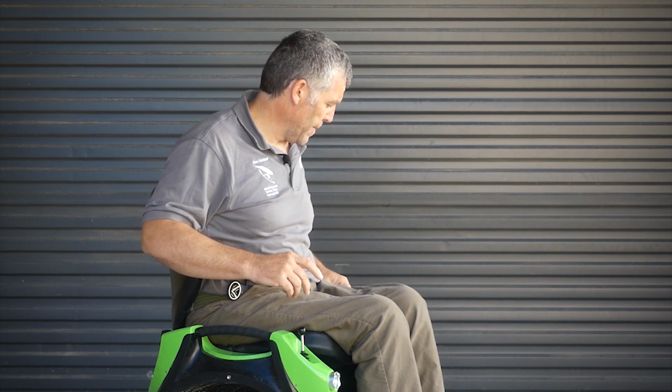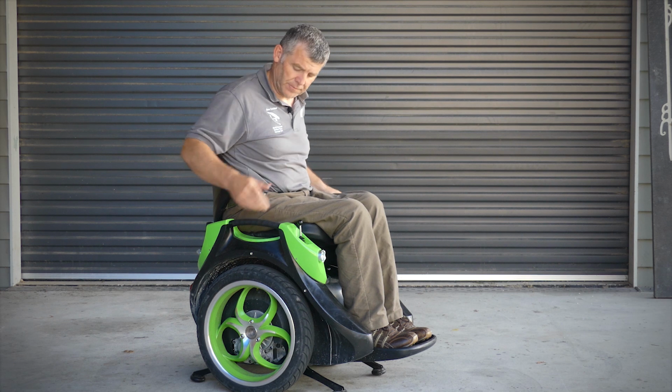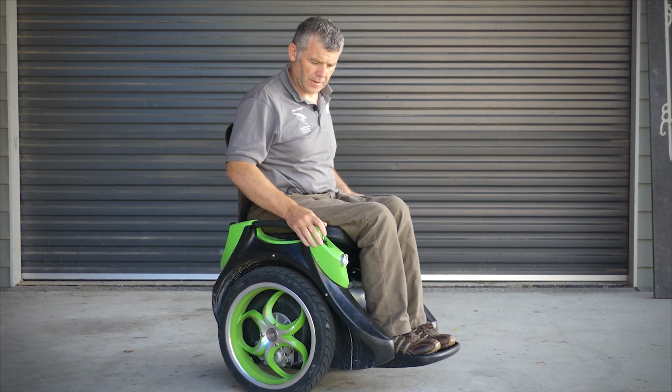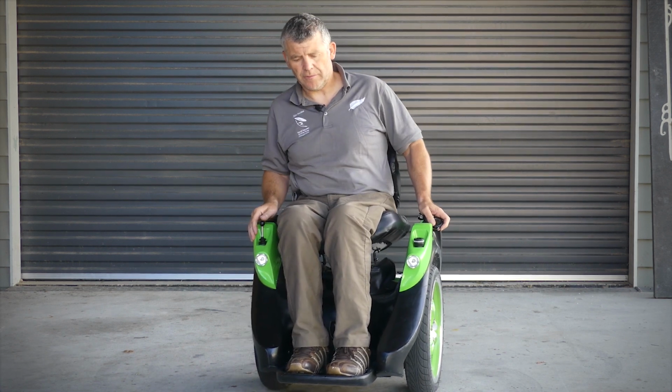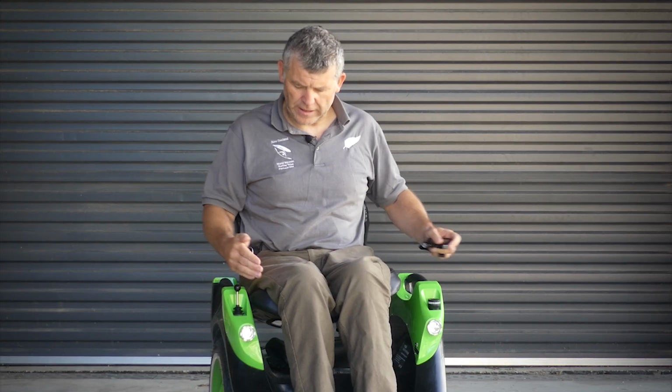So we power up. I'll just demonstrate what not to do. Power on, lift the legs. Using the joystick, you can see I can steer just fine, but I am sitting on an angle. If I sit flat on the seat, you can see the angle there. You'll feel the angle more.